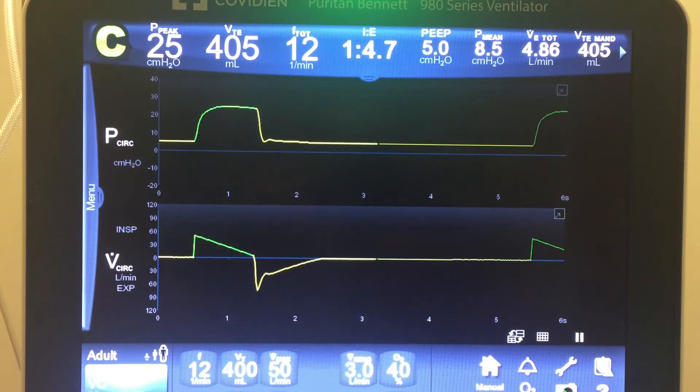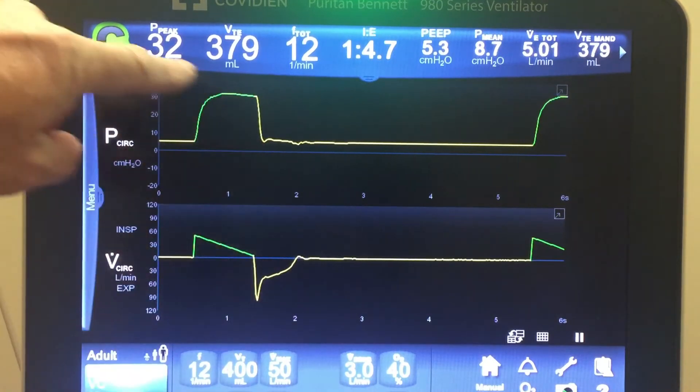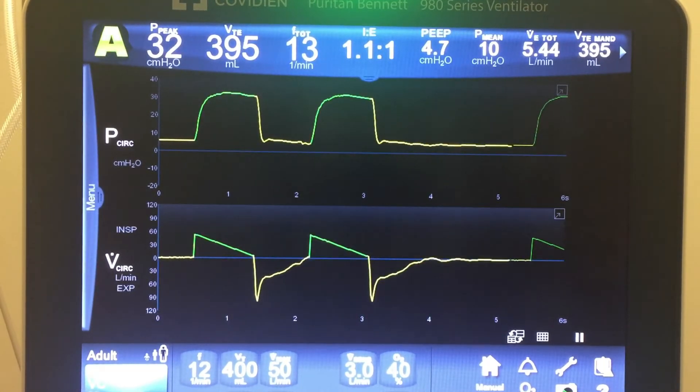If compliance decreases — meaning the lung gets stiffer, from pulmonary edema, mucous plugging, bronchospasm, pneumonia, or atelectasis — something that can happen really fast would be secretions. So I'm going to make this lung less compliant. Watch the peak pressure — it will still deliver 400 milliliters, but the peak pressure will jump up immediately. There we go: still delivering 400, and it jumped right up to a new peak pressure of 33.